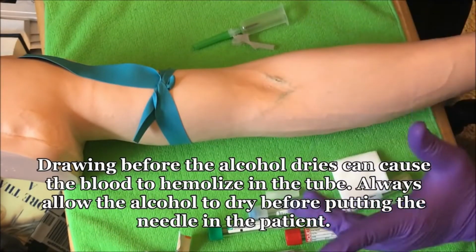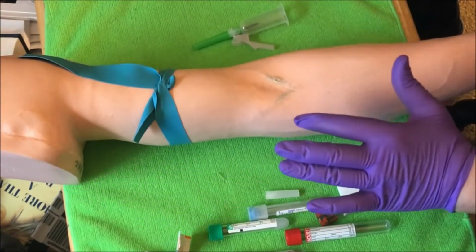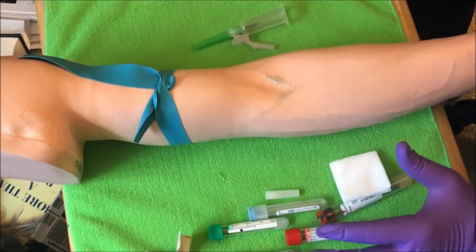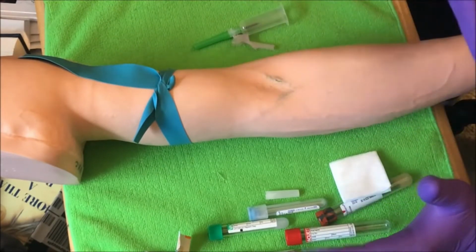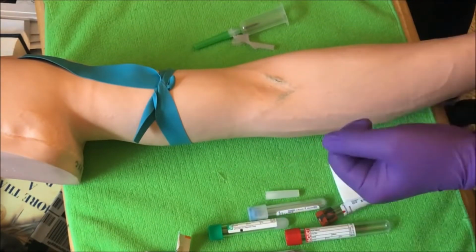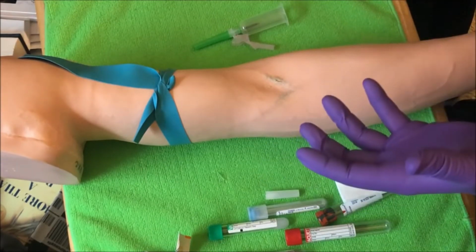Now some textbooks will tell you do not blow, which you don't. You never blow on the site because some alcohol pads are wetter than others. Some textbooks will say don't even wave your hand. I don't mind this. This is not going to stir up air current. If I'm breathing and talking, that can stir up air current. If you're blowing and you're bringing your mouth to the site and putting whatever is in your mouth on the patient.